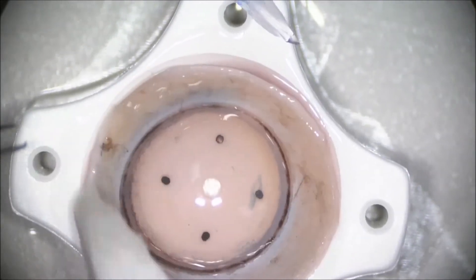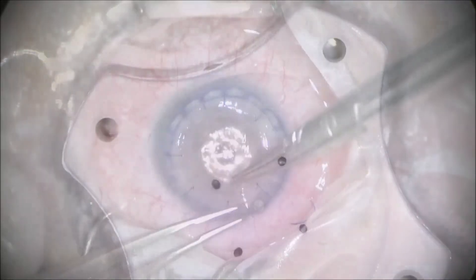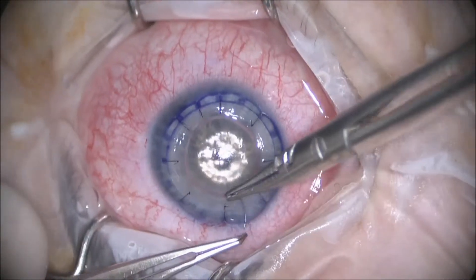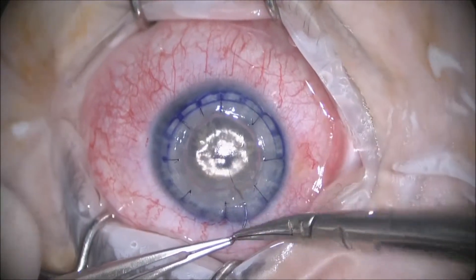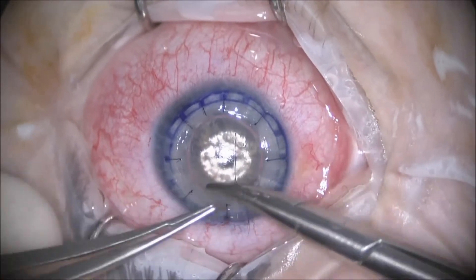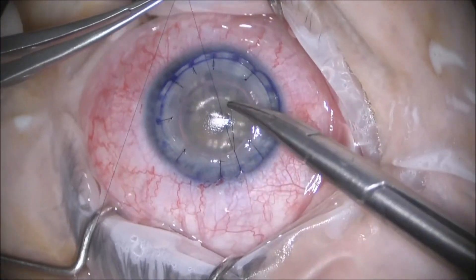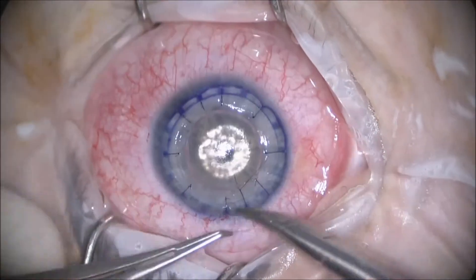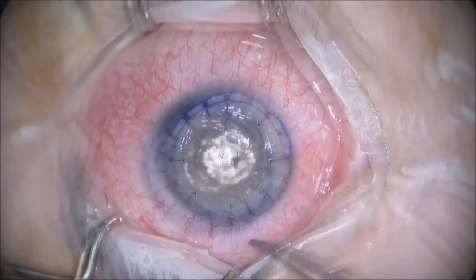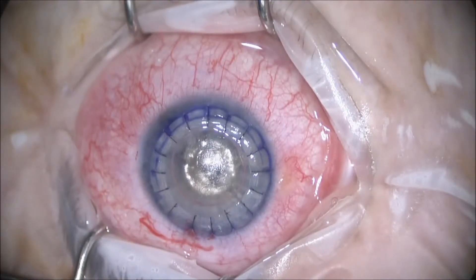We bring our donor graft in and then we suture it into place using a 16-bite interrupted fashion. It's important to tie these sutures a little tighter than you normally would, as they have a tendency to loosen up.